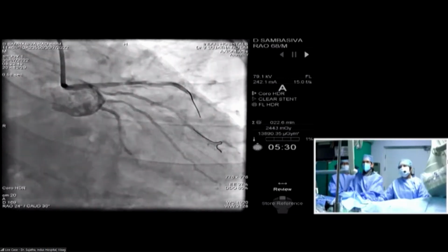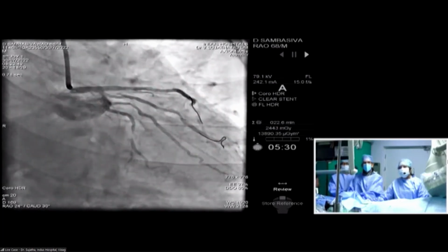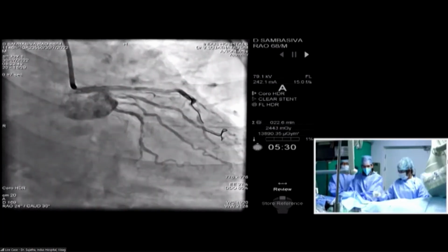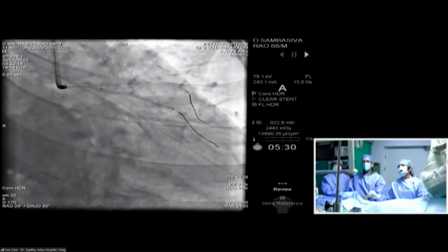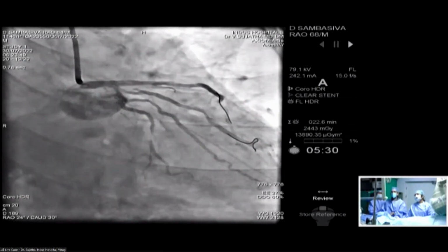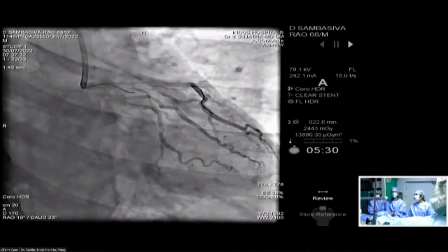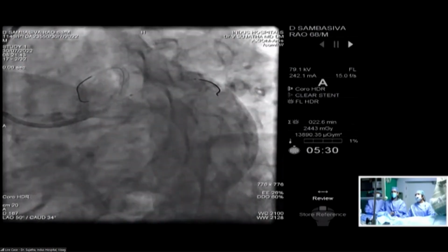Yeah. I would like to see another preparation in the LAO caudal view, exactly where you had a 3 o'clock calcium, and the OCT that is corresponding to that 3 o'clock, in the LAO caudal view. We've taken one level. After preparation. Yeah.